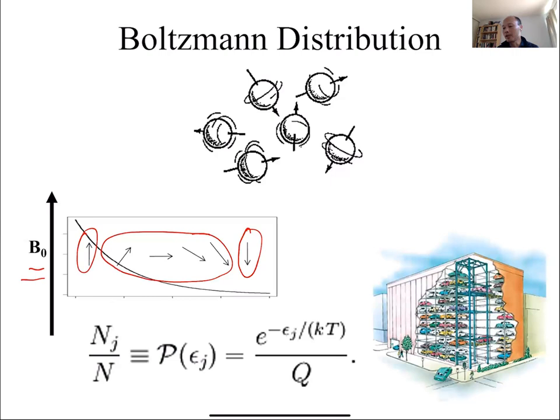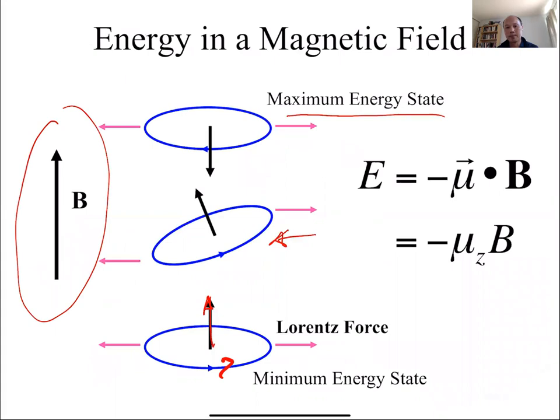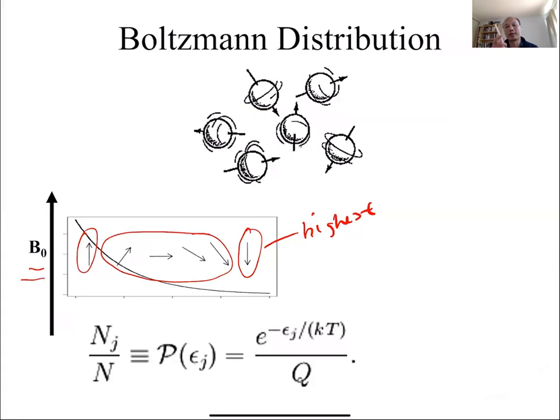Sorry, I was going to say, could you explain again where a particle would be in the highest energy state? Yeah, this would be the highest energy state. I was thinking of the last slide, like which orientation? What's the frame of reference here? This one here? Which slide? Okay, you're referring to a particle in a magnetic field that is spinning. At this point, it's not spinning yet. It's like the compass example: if you have an external field and you have something with a magnetization to it, it's going to be in its lowest energy state when it's pointing along that field. Okay, gotcha, so we haven't talked about spinning at all yet. Yeah, but that's a good question.